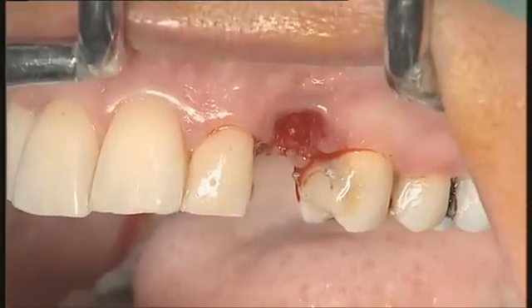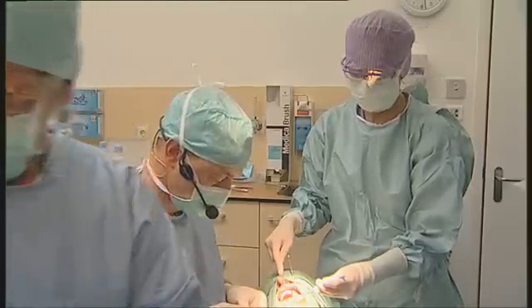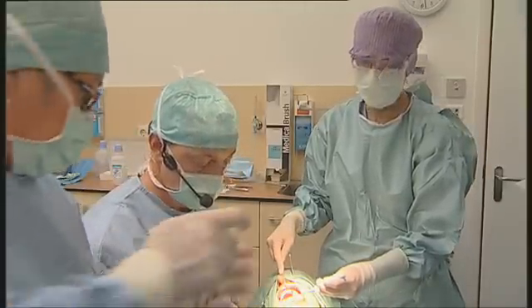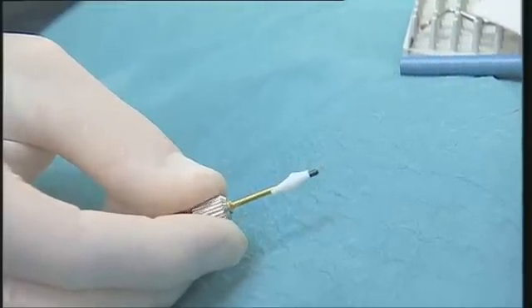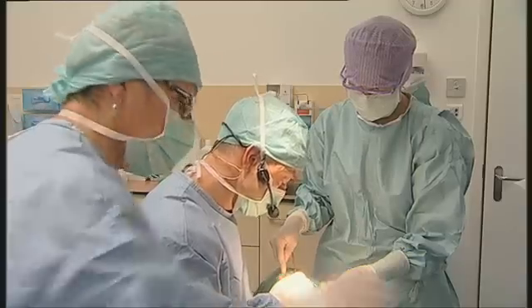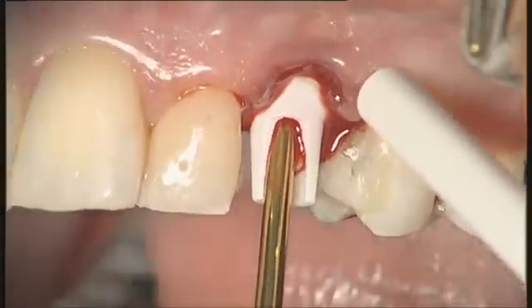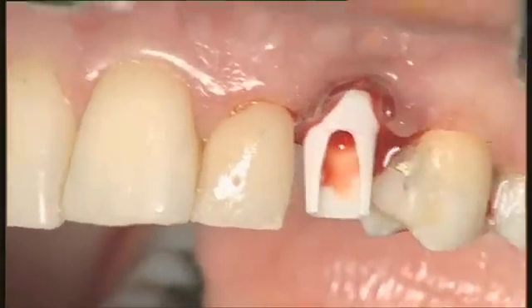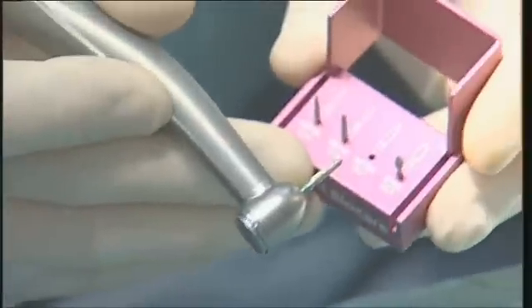We will be ready to go one step further: the placement of our zirconia abutment, or at least a try-in of this zirconia abutment. This is the abutment I intend to try in — it is an aesthetic zirconia abutment. We will try it in. It looks quite nice.